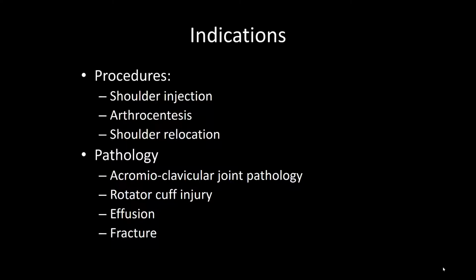Another application is for shoulder dislocation and reduction. Some pathology we may encounter is AC joint separation, rotator cuff injury, effusion, or fracture. One caveat is that ultrasound is not very sensitive for most of the shoulder pathology.